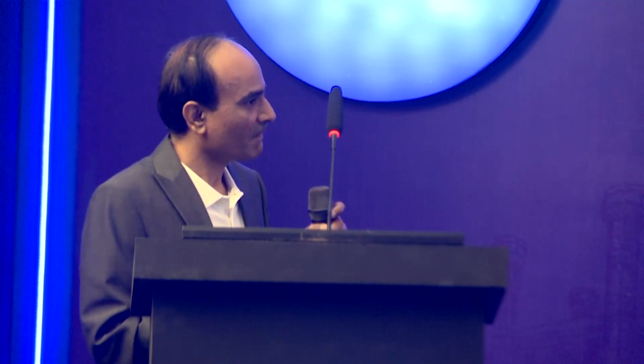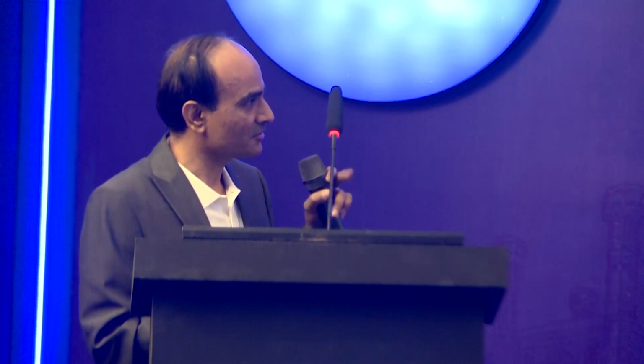At the ostium of the left main, where there were struts hanging, it probably got stuck at the guide tip or some struts over there, and it's lying there. So how to get rid of this now? But this happened after the slow flow. The balloon got stuck there after you gave the Aggrastat, which was much later in the complication. Yes. So how to remove this?